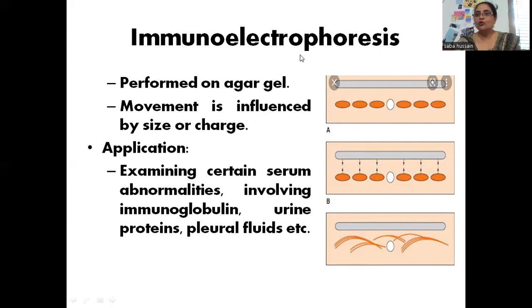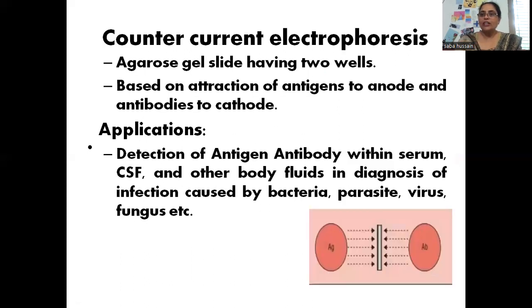So this is called immunoelectrophoresis. This is immunoelectrophoresis, simple immunodiffusion as well as electrophoresis combined together. Now, a step further is counter current electrophoresis.